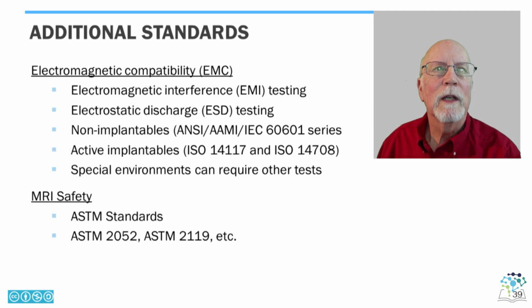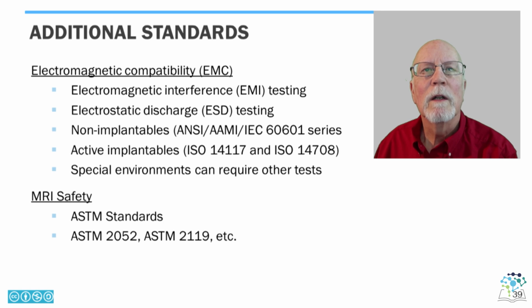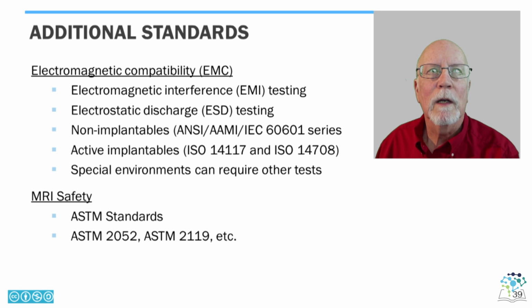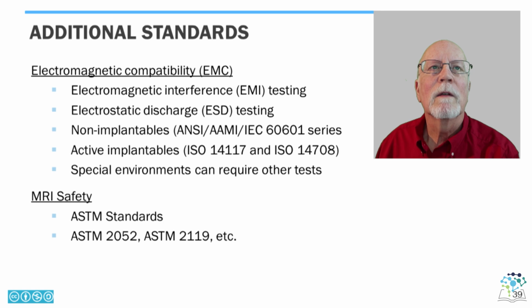Electromagnetic compatibility, or EMC, is yet another area for qualification, including both electromagnetic interference testing and electrostatic discharge testing. Devices for these assessments can be separated into non-implantables and active implantables, again, each with their own applicable standards. And finally, MRI compatibility and safety also have their own specific standards evaluating both patient safety as well as maintenance of device functionality in the presence of high magnetic fields.